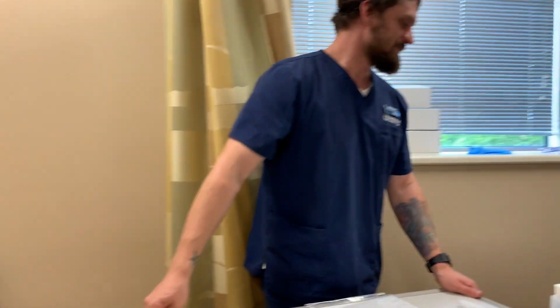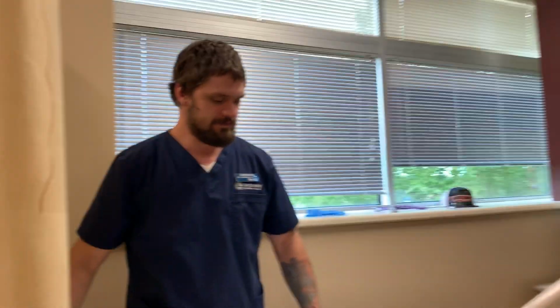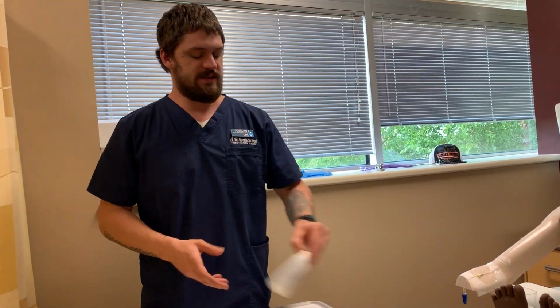All right, so hi, Miss Doe. My name is Jordan. I am the student nurse on the floor today. I hear you're having some pain. Yes, lots of it. Lots of pain. Awesome. Well, I'm going to provide for privacy for us here and wash my hands.